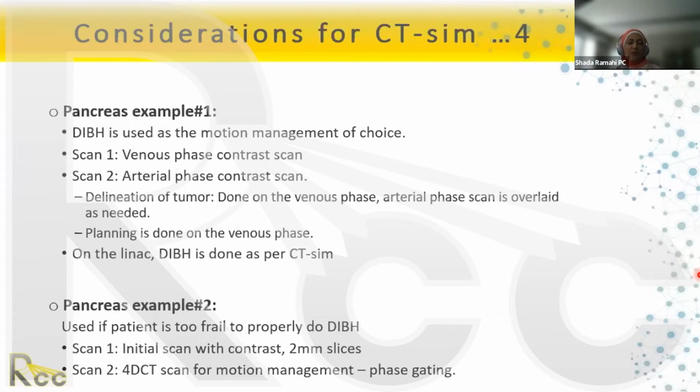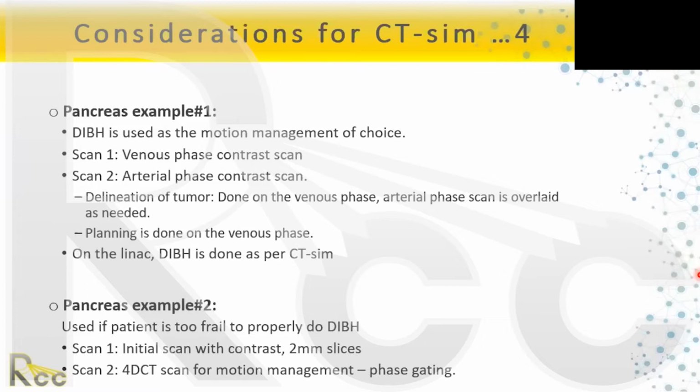And so basically, it's just a single scan that includes both the motion management and the contrast image. Also, it depends on what you have.